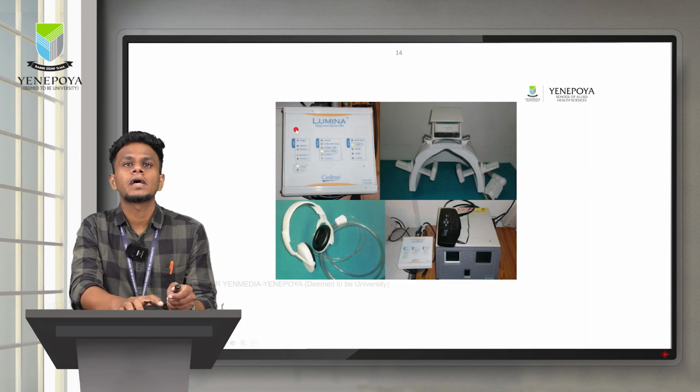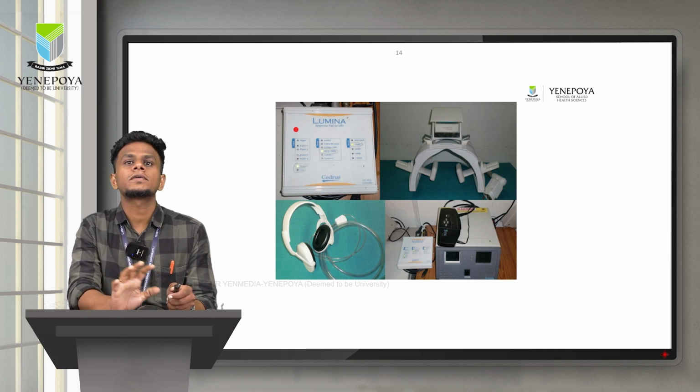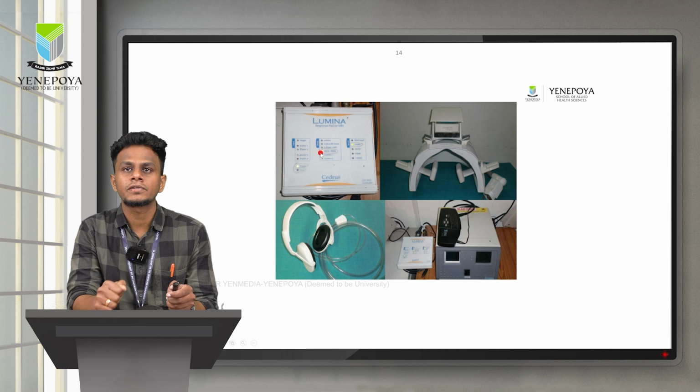The response pad's function is to capture that activity and synchronize it with the MR signal. Once the response pad receives the signal of whichever activity the patient gives, simultaneously the MR acquisition is going to happen. Those data are synchronized together, and finally we get the fMRI data.